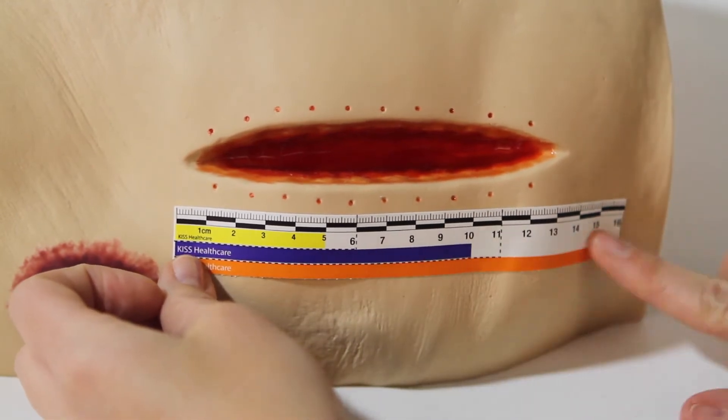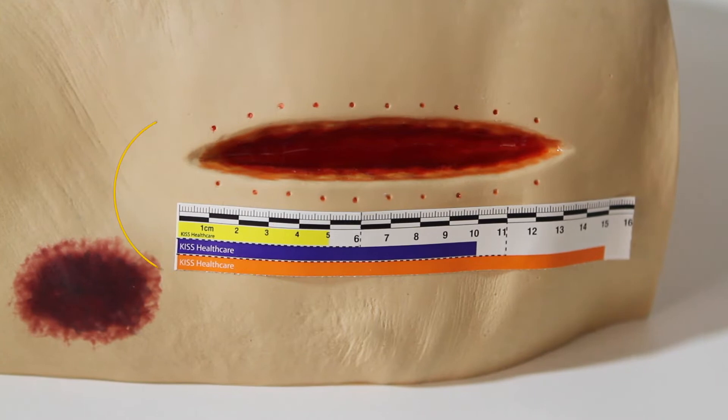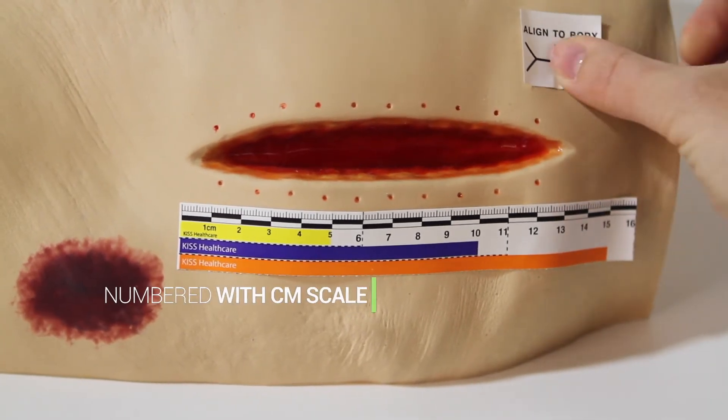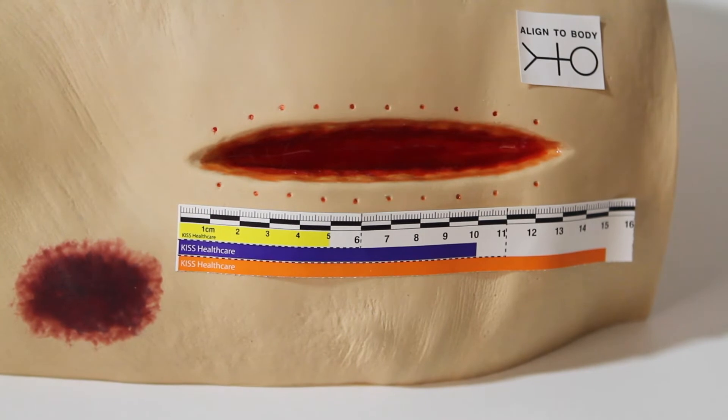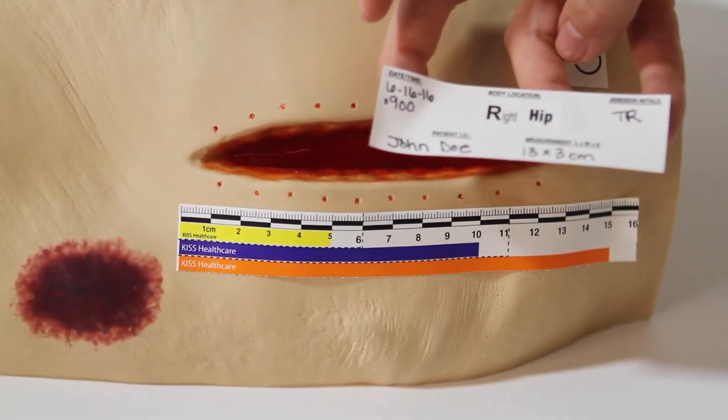Next, place the KISS stick figure next to the wound, aligning the stick figure in the same position as the body. Fill out the note label and apply next to the ruler.